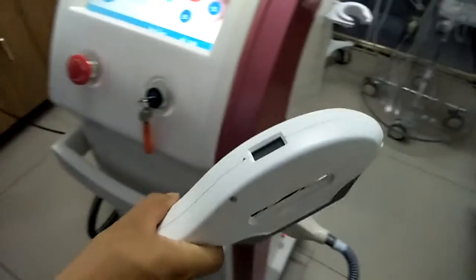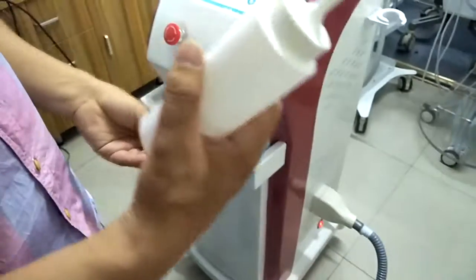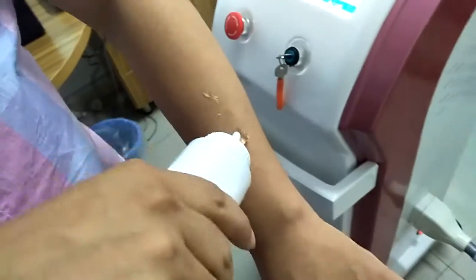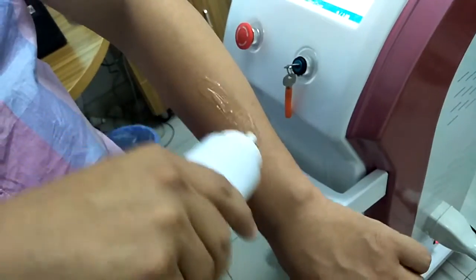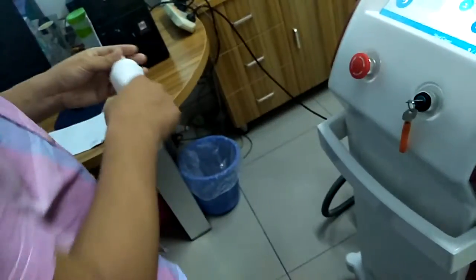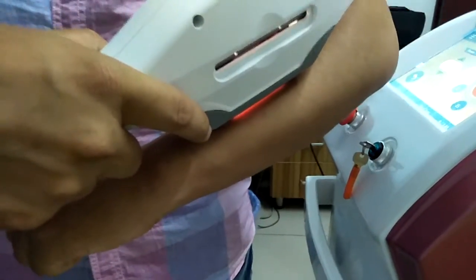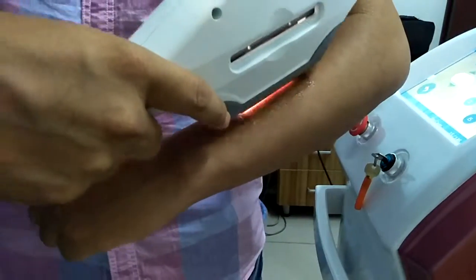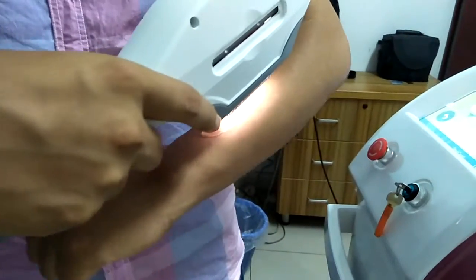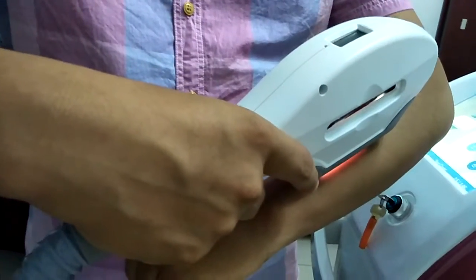If we want to do the treatments, we can put some gel on the skin and make it even. When you feel heat and it's getting in, it means the energy is proper.